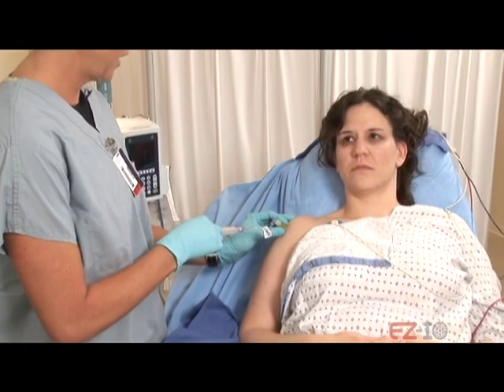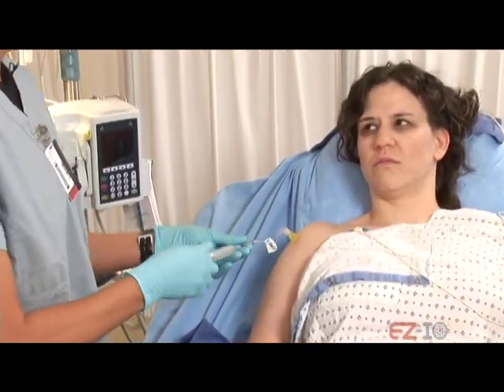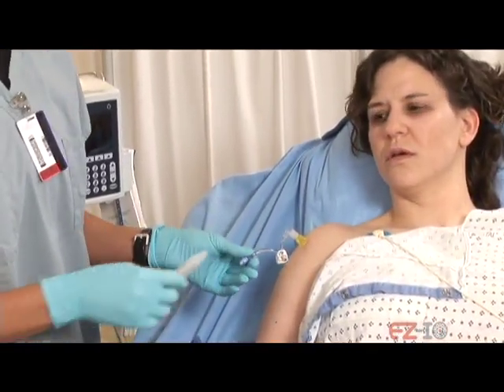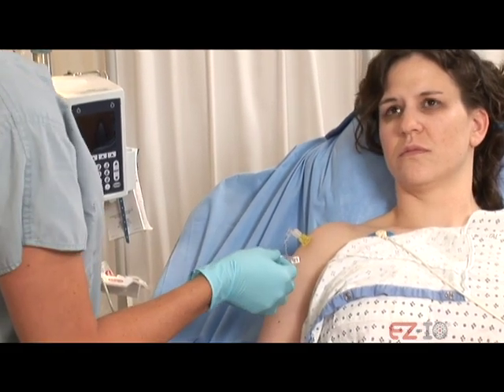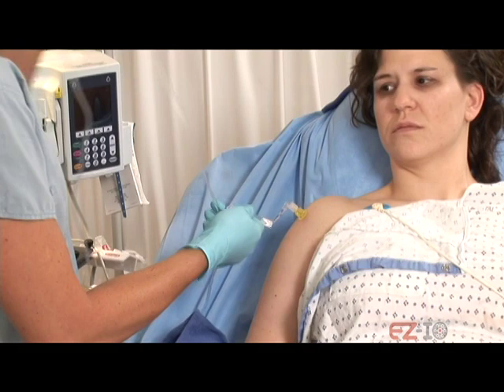Okay, what's your pain level at now? Probably like a 1 or 2. Great, great. So now I'm just going to hook this up to our IV tubing, and that's going to run the rest of that medication in.